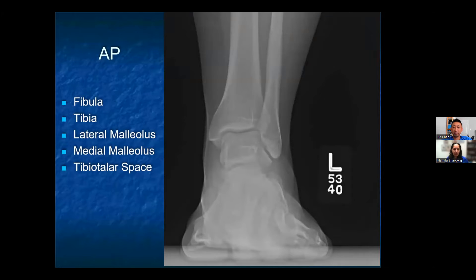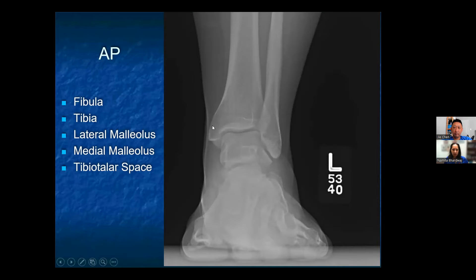When you first look at the AP, the distal fibula should be slightly superimposed on the tibia. The lateral and medial malleoli should be in profile, and then the tibio-talar space should be open, although the full mortise isn't visible.